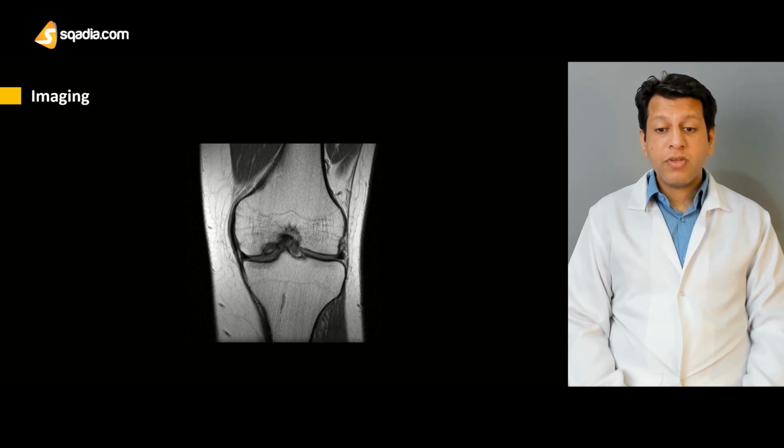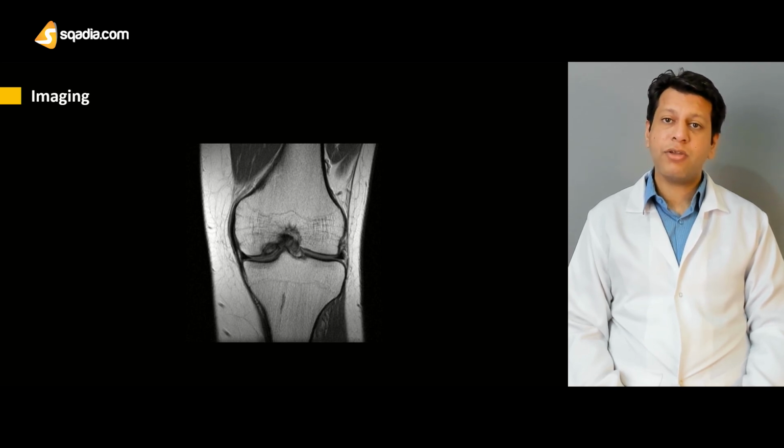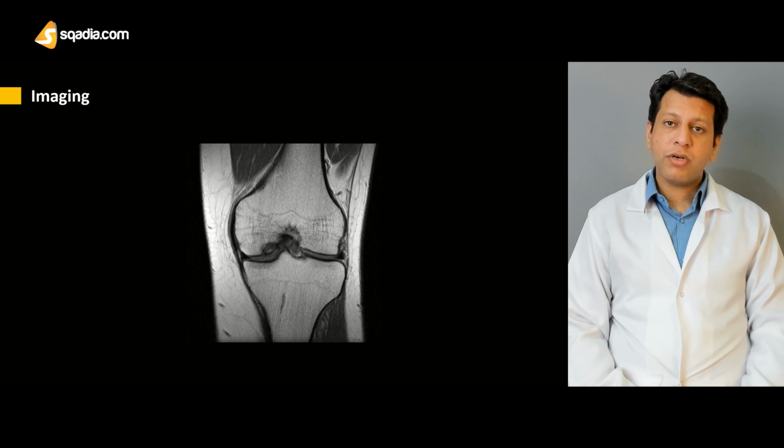The other option we can go for is usually the MRI. Why? Because MRI actually confirms our diagnosis. Also, we are able to exactly diagnose whether it's a stable or unstable lesion. And further, we are also able to understand the exact size of the lesion.